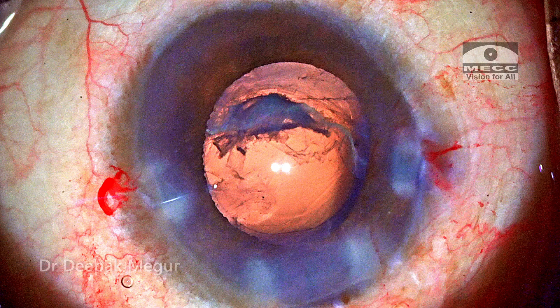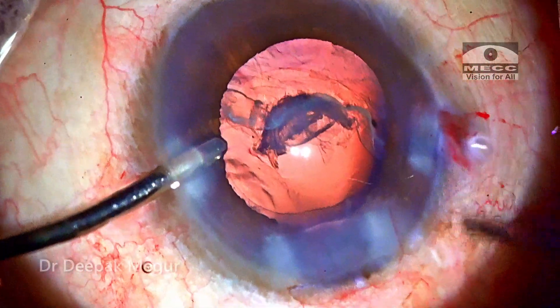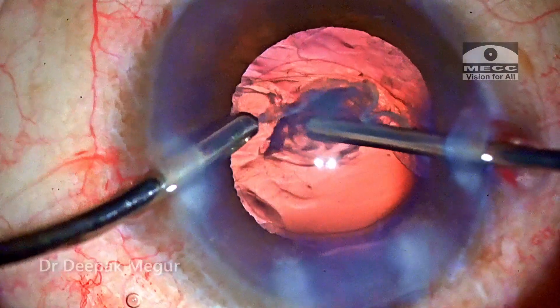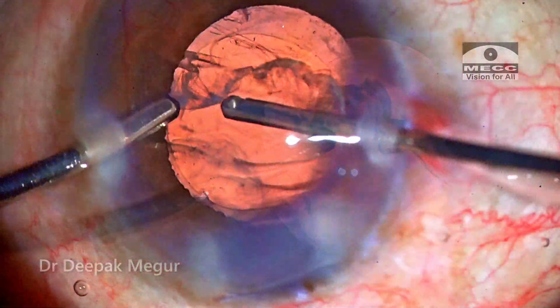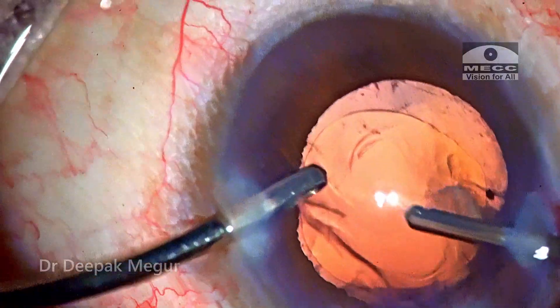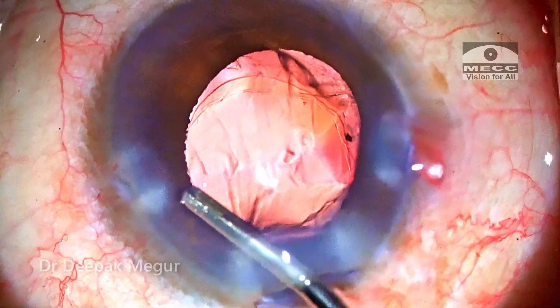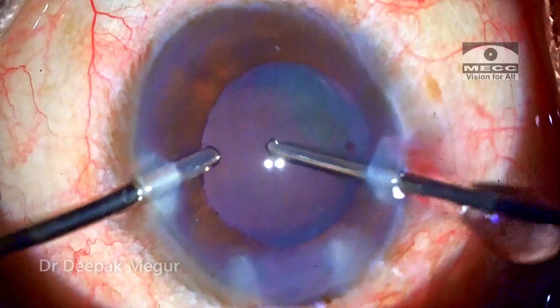I'm not going in with bimanual I&A to remove the epinucleus, because the epinucleus would be sticking onto the posterior capsule quite strongly — and in the process of pulling it, I could end up rupturing the anterior hyaloid and tugging at the vitreous. Instead I'm going in with the vitrector to deal with the epinucleus and also do a limited anterior vitrectomy. The loose epinucleus flows out, while the epinucleus sticking onto the posterior capsule has to be cut and aspirated by the vitrector. The posterior capsule is trimmed and hands are switched so that lens fibers from the other quadrant are also taken care of. Triamcinolone acetonide is pushed in to confirm the absence of any vitreous remnant.